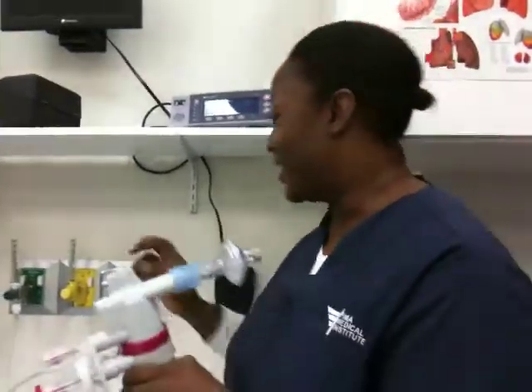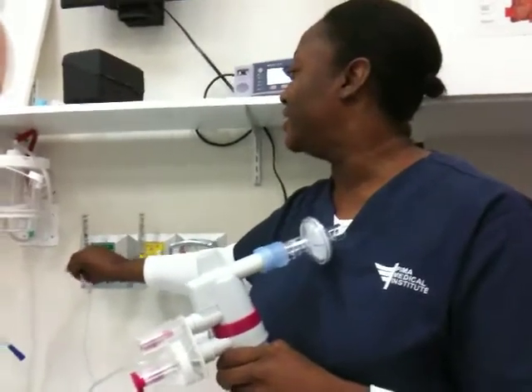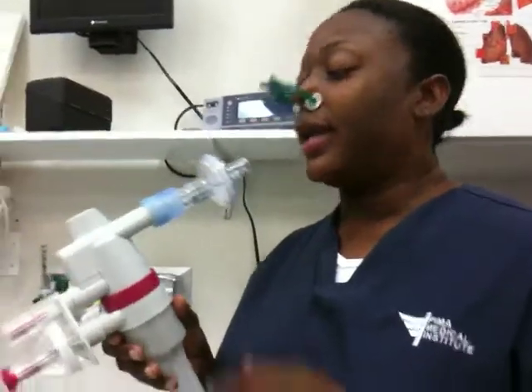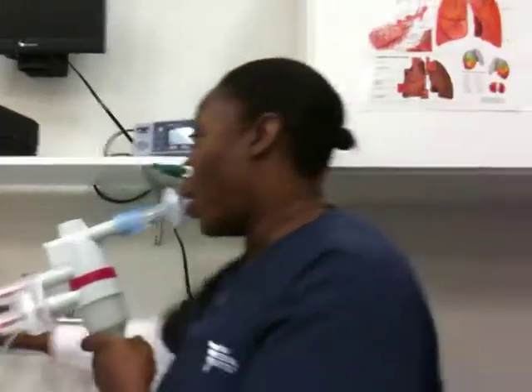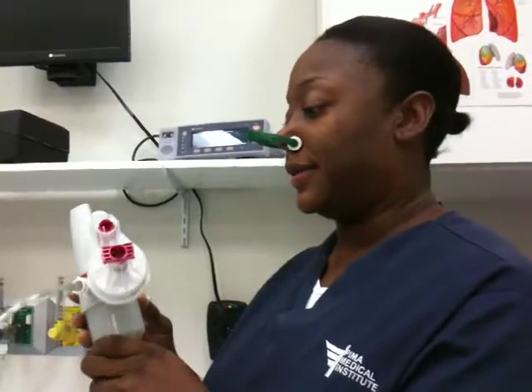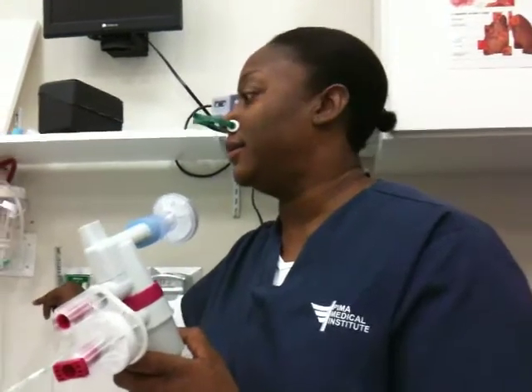I'm going to wait, I'm going to cut it off first — I want to be able to breathe. What do you need the nosepiece for? So you don't exhale any of your nose. I exhale through the nose. Yeah, technically. I think this can be done with or without a nose. I got a 15 liter. That's hot. That's so that it vibrates in your chest and brings it up.